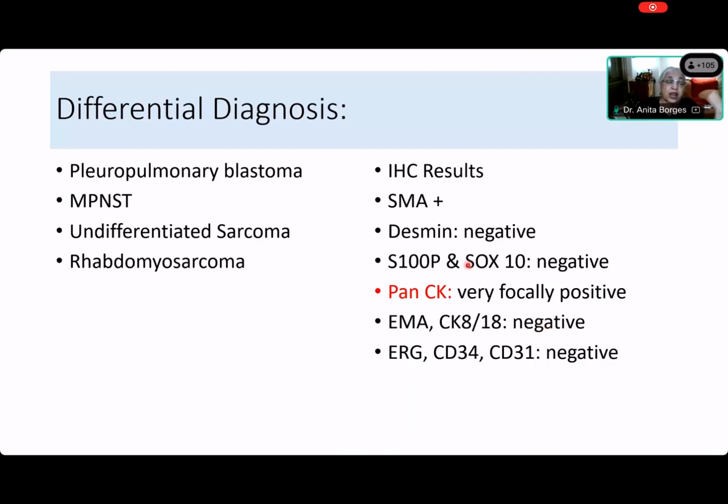So then, because it is a child, because it is in the chest, just like our synovial sarcoma was in the chest, okay? It could be a pleuropulmonary blastoma, MPNST, naturally, because it's got necrosis, undifferentiated sarcoma of some sort, or rhabdomyosarcoma. And you have to do the immunohistochemistry. And what did we find? That the SMA was positive, and there was very focal pancytokeratin. Everything else was negative. So now, come on, Priyamada, can it be a synovial sarcoma?